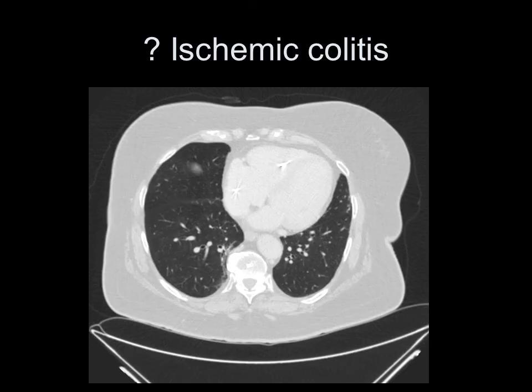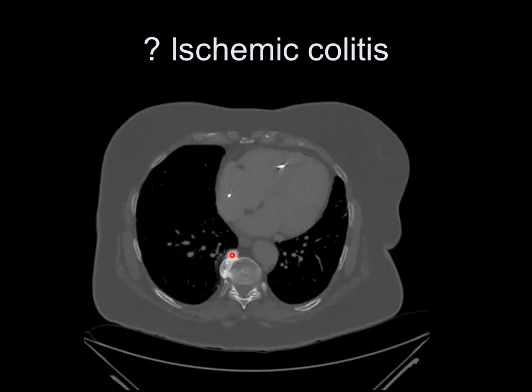This is a pattern which is quite commonly seen. You've probably noticed it before. This curling pattern of linear density, which is seen very close to osteophytes. You can see it here in bone windows. I'm not sure what the explanation is, but it's perfectly normal. You can comment on it if you wish, but don't make anything of it.